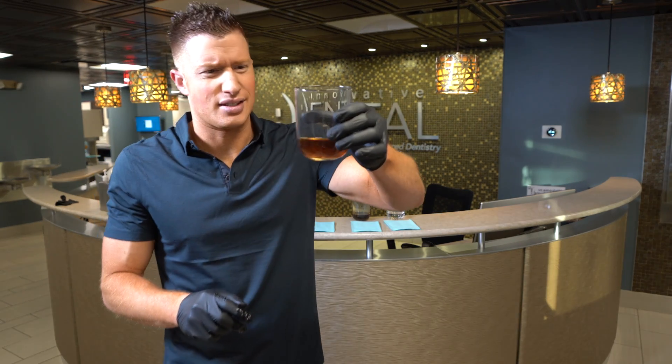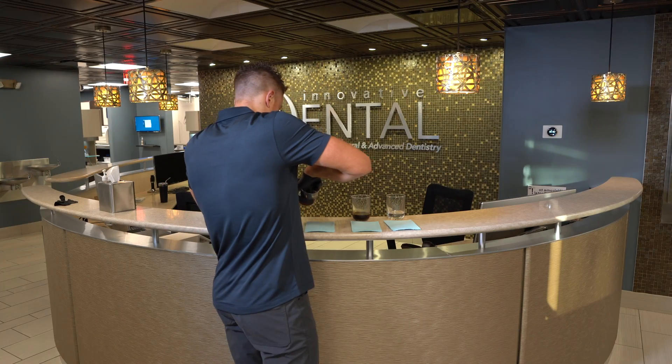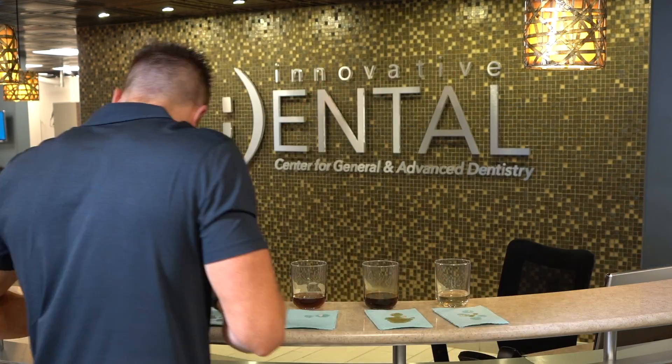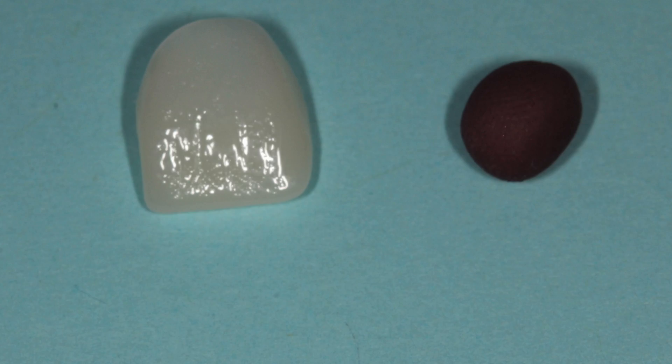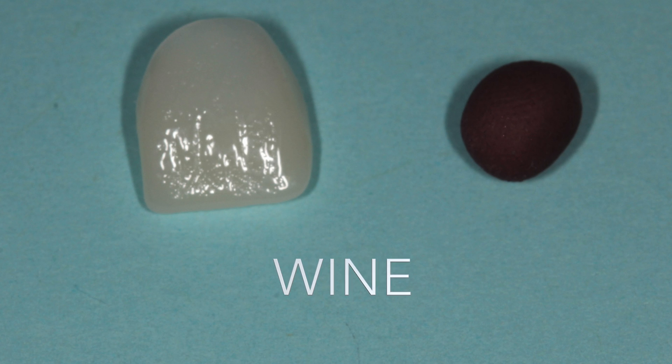There's like stuff growing in that one — yeah, I don't want to get into that. Now that we've got all the veneers and the composite out of the glasses, it's time to take the shade gun and see: did they change at all? As you can see with the wine, the all-porcelain veneer didn't take up any of the stain, while the composite was pretty dark — almost looks purple.